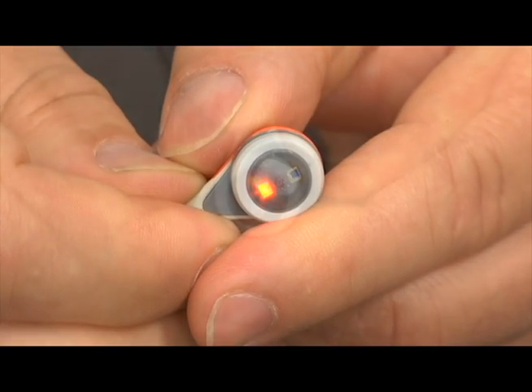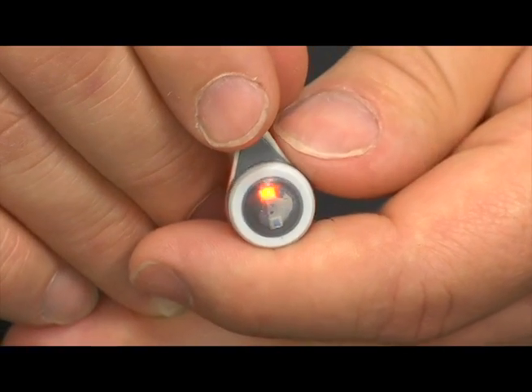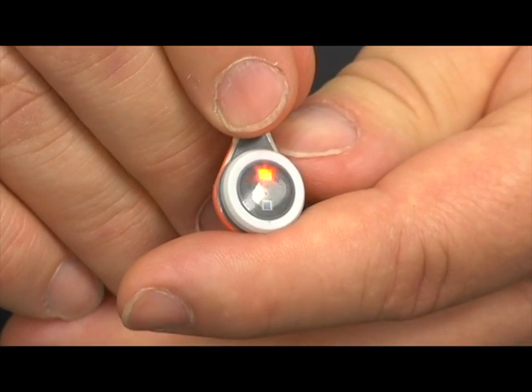This is an example of an air bubble beneath the sensor membrane. If this condition is present, repeat the re-membraning procedure.